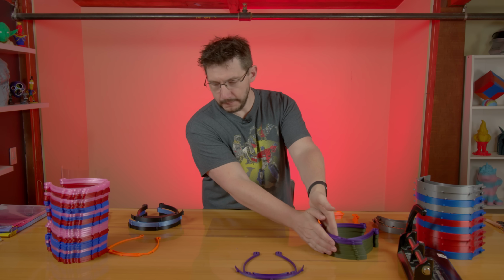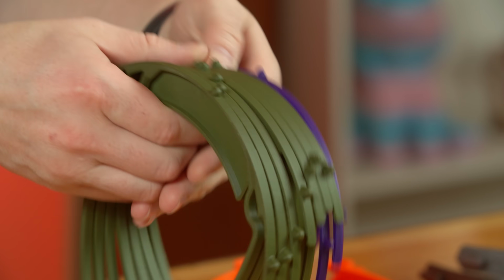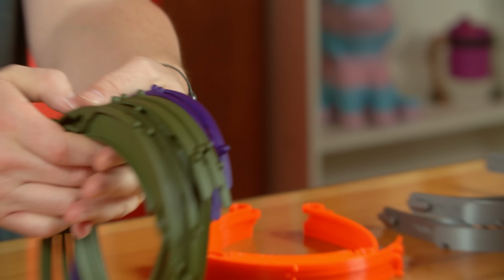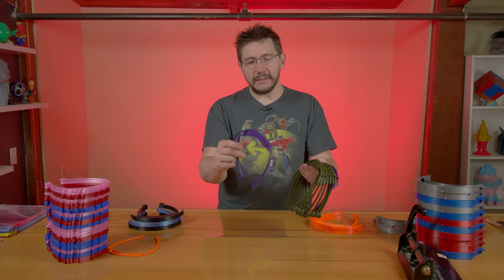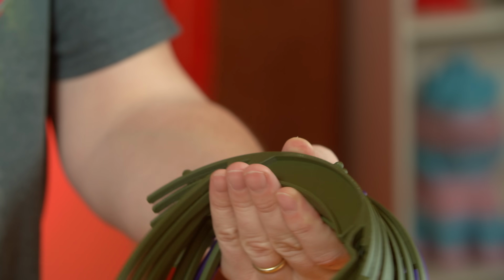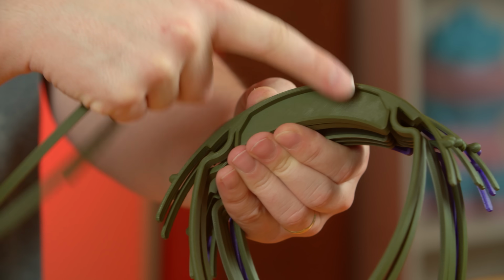And I can tell you right now, these are PLA, and they're already taken apart. These are in PLA. These stacked pretty darn well. They were able to come apart, but one of the things that I noticed is that one of the original designs had this little inlay right here.